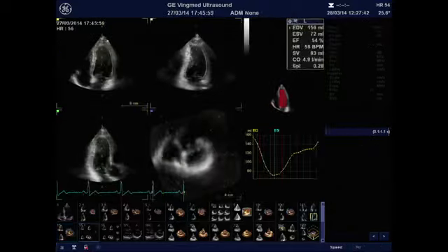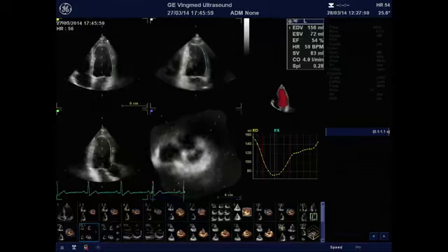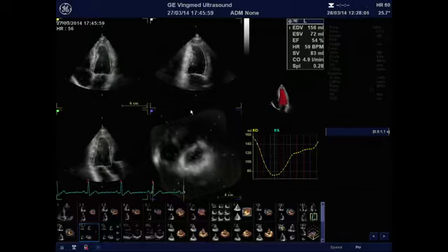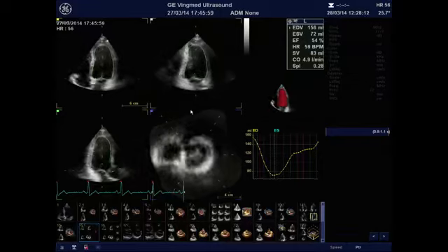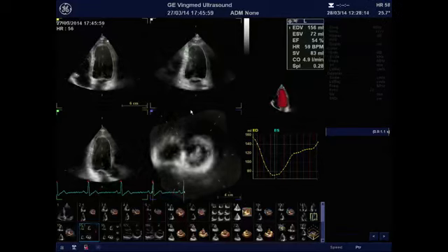It's also important to say that using these full volume acquisition, we can also acquire the different orthogonal planes and, putting some samples at the level of the base and the apex of the left ventricle, we can automatically or semi-automatically measure the ejection fraction. This is, of course, a very robust tool since it's semi-automated, and there is no problem of foreshortening that we can have with 2D, because there is no geometrical assumption, which is, of course, the guarantee of a better reproducibility and accuracy in the measurements.